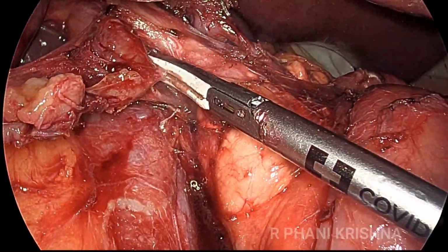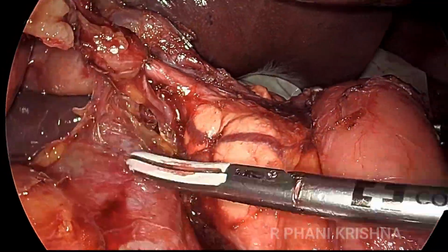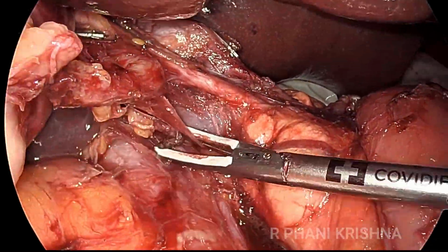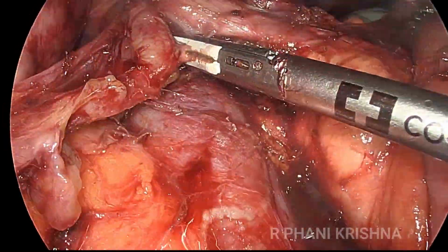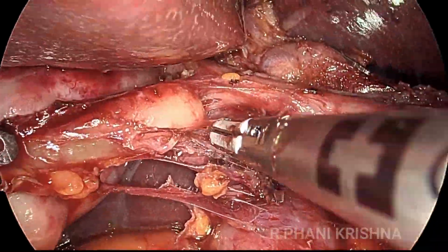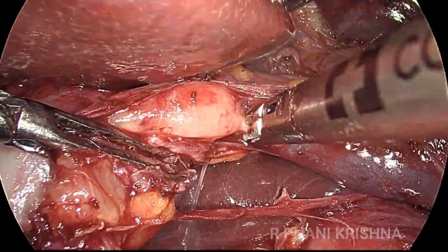Identifying the surface of the portal vein gives us the main landmark, and once we identify it, the dissection proceeds fairly easily. All the retroportal lymph nodal tissues of this side are dissected, and the specimen on the opposite side is also delivered onto this side, and that completes the retropancreatic and the retroportal lymphadenectomy.